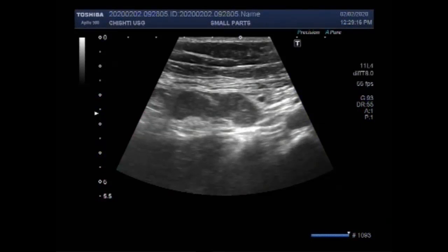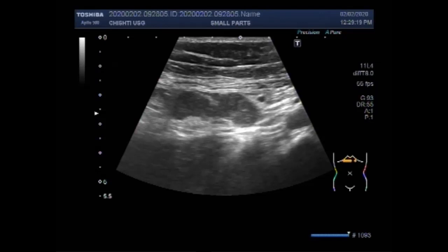Dear viewers, I hope you are all fine. This ultrasound video shows multiple enlarged mesenteric lymph nodes. The enlarged lymph nodes are seen on both sides of the abdominal cavity.